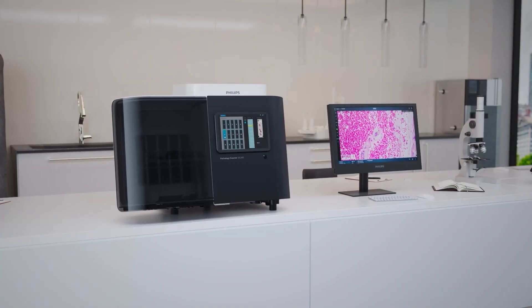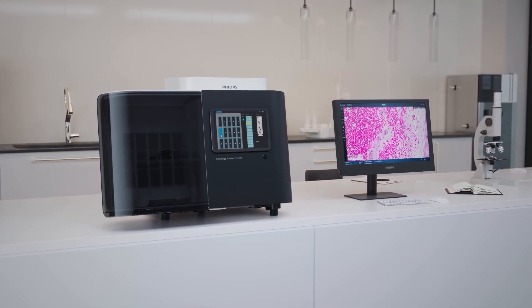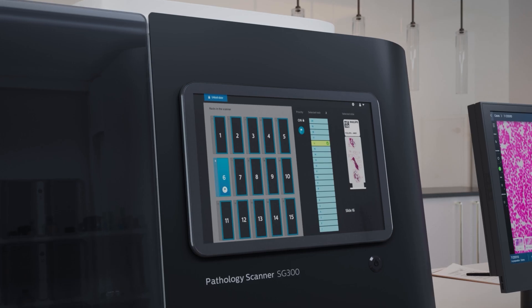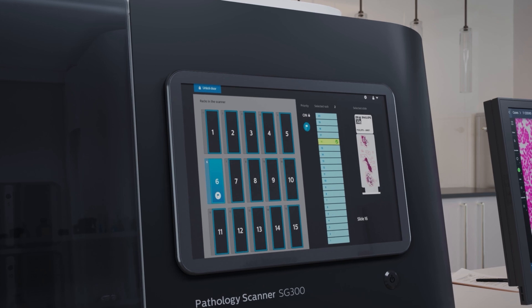Slide scan assurance is performed before every scan to ensure scanning only takes place once the quality parameters have been checked and qualify. Stage, camera, and light source are constantly monitored during acquisition.